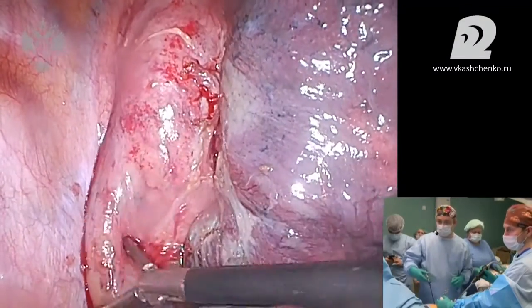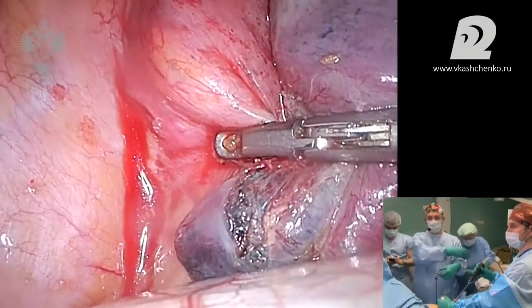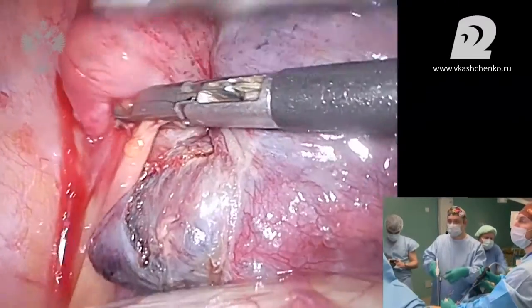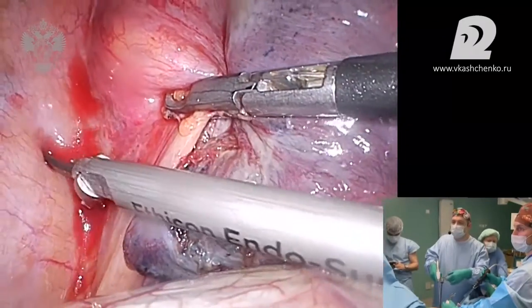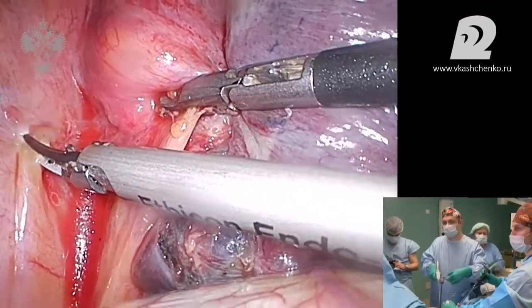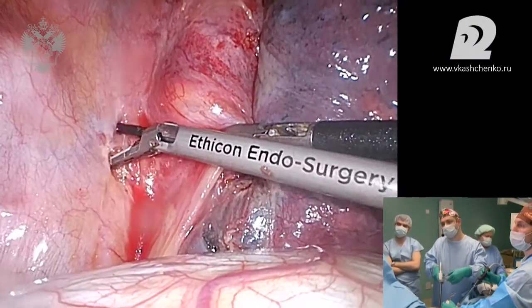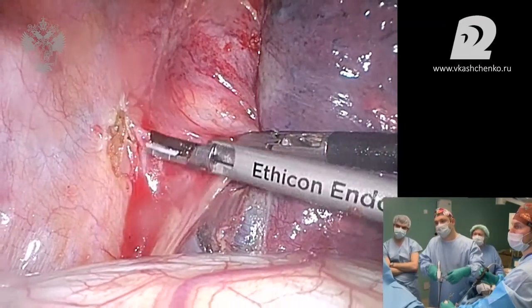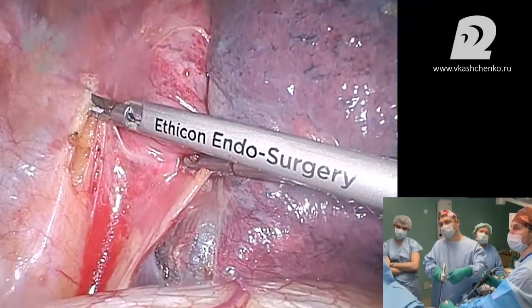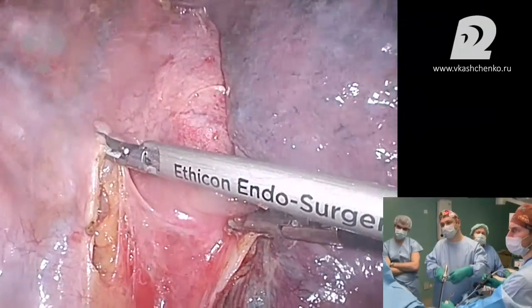Clamp. Harmonic. It's part of the aorta. We'll remove the water a little. It's aorta, backwards, a little bit backwards, so that I could see it properly. Aorta. Yes, we can see it properly. And we have to approach the layer that we have processed and treated from the other side. So we are going to open it a little bit wider.